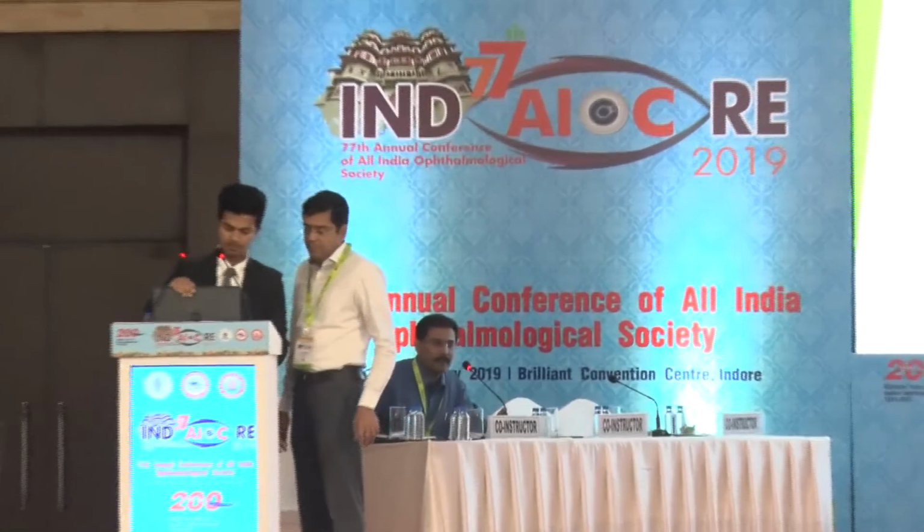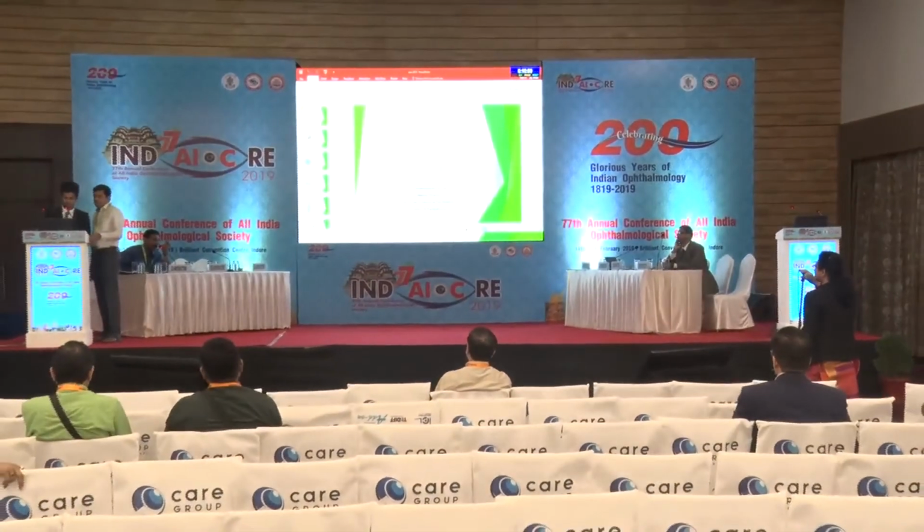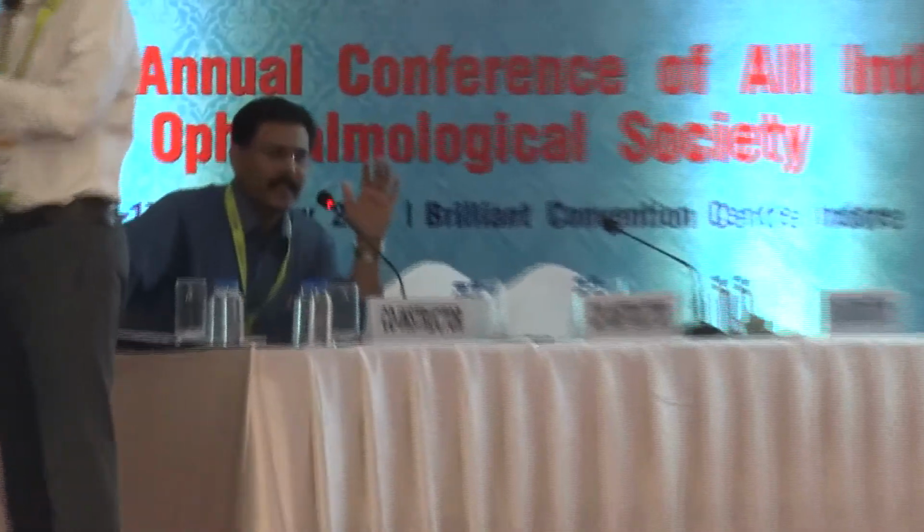Just a question, we all know that we do need an intact rhexis for a multifocal IOL, but in the event you have a small rhexis rupture, is there anything you would like to advise for the rescue? Yeah. Many of these single piece IOLs, if the rhexis margin, for example, has a tear in the inferior 6 o'clock, you place your haptics oriented hitting the equator at 3 o'clock and 9 o'clock, and take out all the viscoelastic, it usually stays in place. The one rhexis tear just remains open like that. You will get PCO, but that is different. But the centration part usually doesn't create a problem.